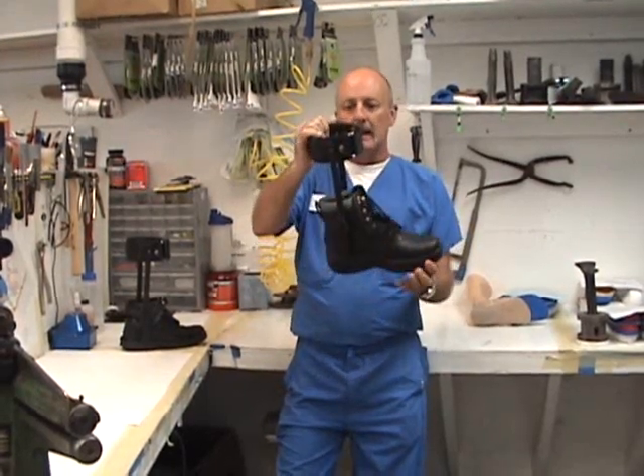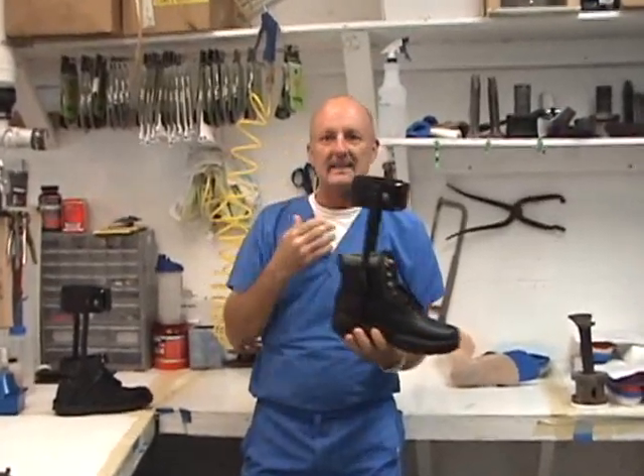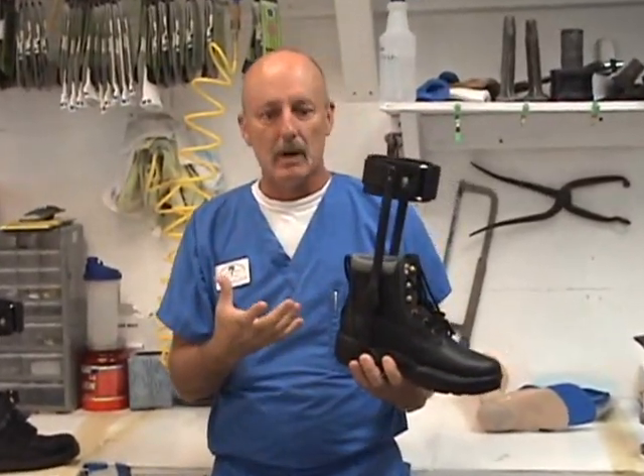That's what this is here. Basically, limited motion means that the brace itself doesn't move. It's designed to restrict ankle motion.